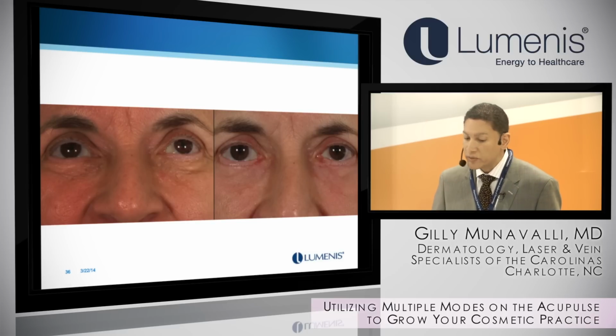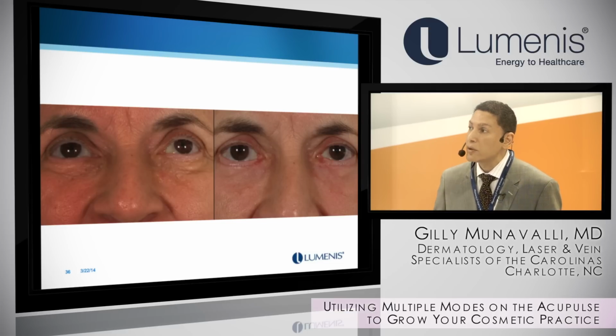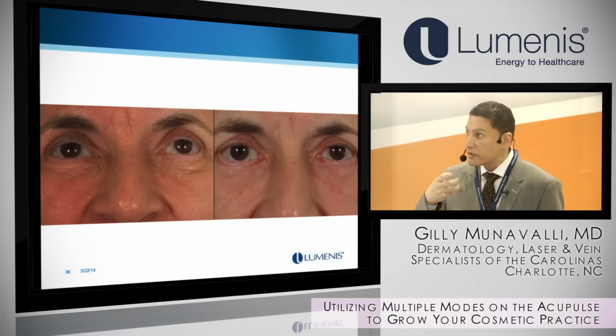Another example, this was a transcutaneous, not a transconjunctival bleph, but made the incision with the laser, took out some extra skin, and then used both the fine touch and the combo mode to resurface around her lower lids. So she got rid of syringomas, extra skin, and you can see the difference here using the combo mode all over to get blending.